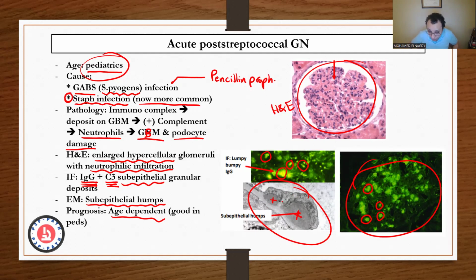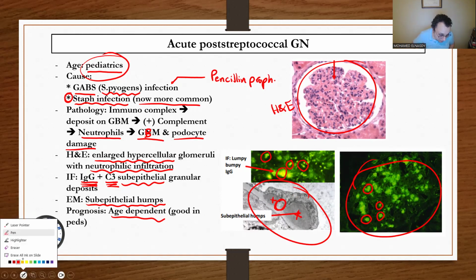I often say that I see the same thing here. What do you see here? What do you think this is? I potentially see the same thing here. What do you think about this? Can anybody comment about what I highlighted right there?